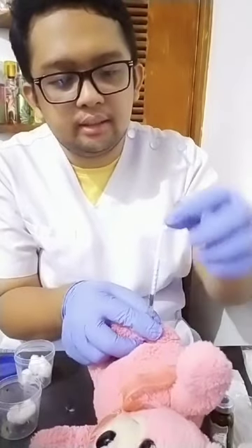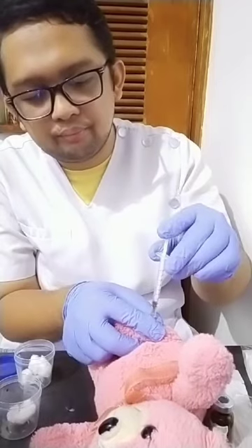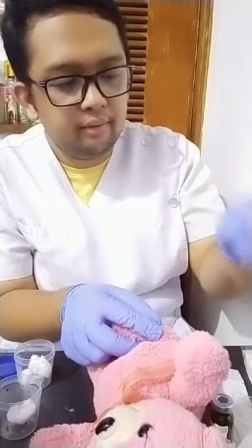Pinch it slightly like this, and then 90 degrees. Aspirate for blood, if there's none, continue. Then put a dry cotton ball, applying pressure on it.